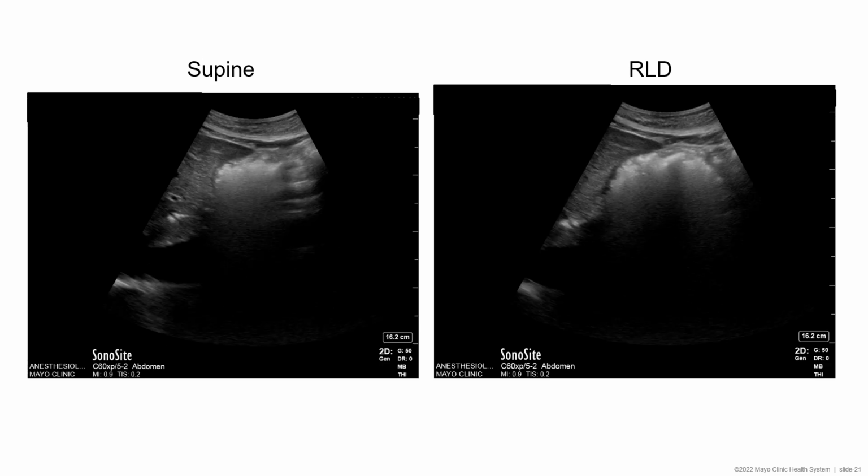So what do we think of this image? The dropout from the air and solids, that's a giveaway. This is a recently full stomach. We can appreciate this in both supine and right lateral decubitus positions.